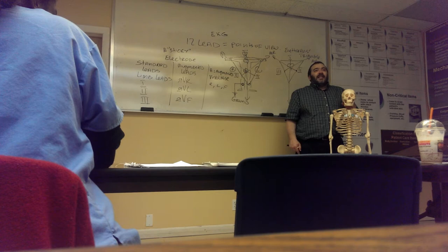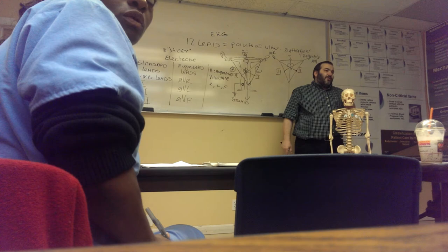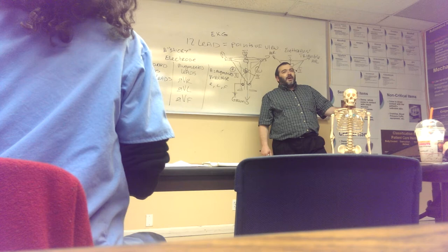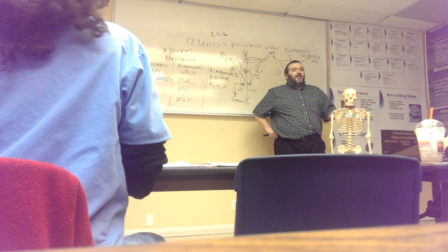You need to study that text over there, and it's also on your handouts. So if I ask you, where's V3 located? You say between V2 and V4. But if I ask you, where's V4 located? You better darn well tell me. It's on the fifth intercostal space along the midclavicular line. And you should know what these words mean.